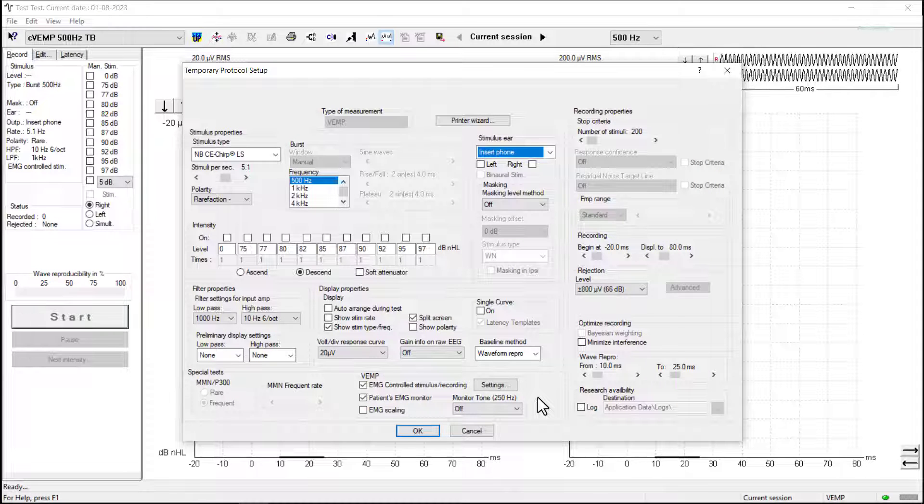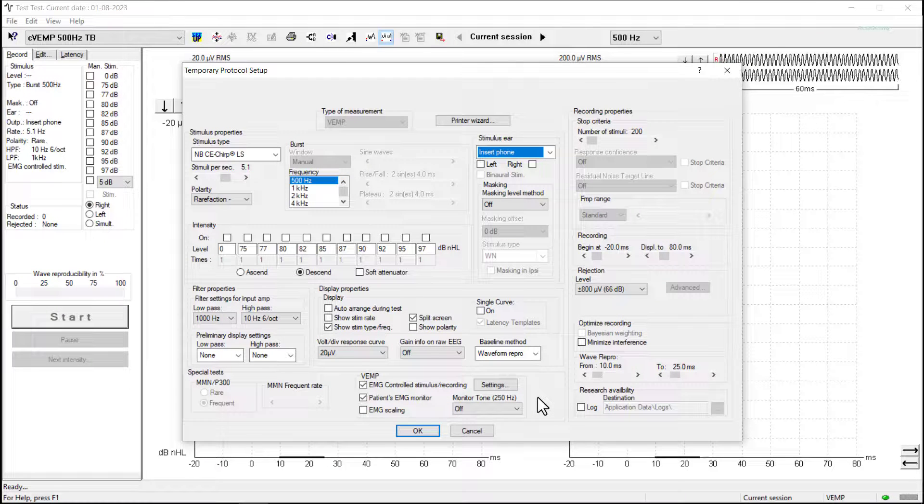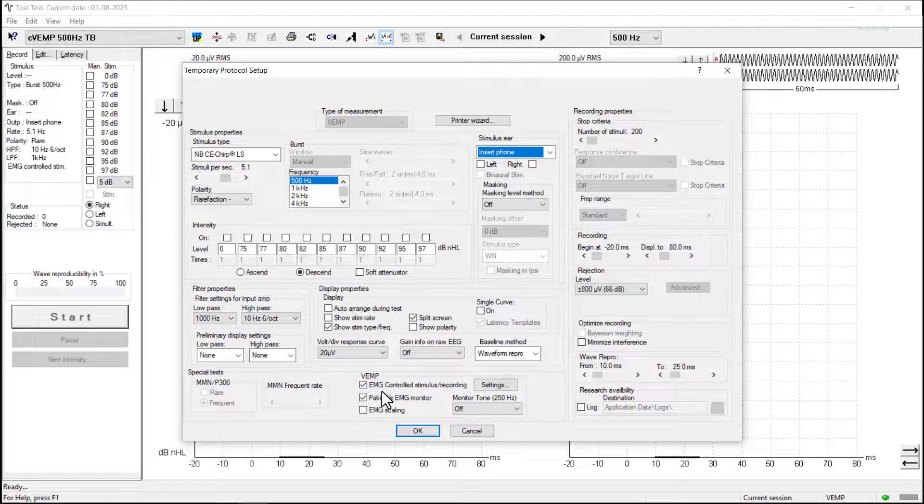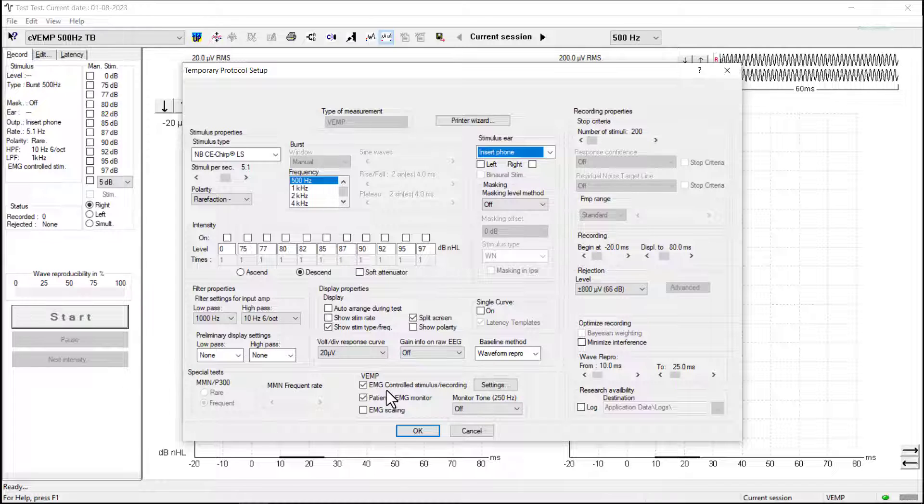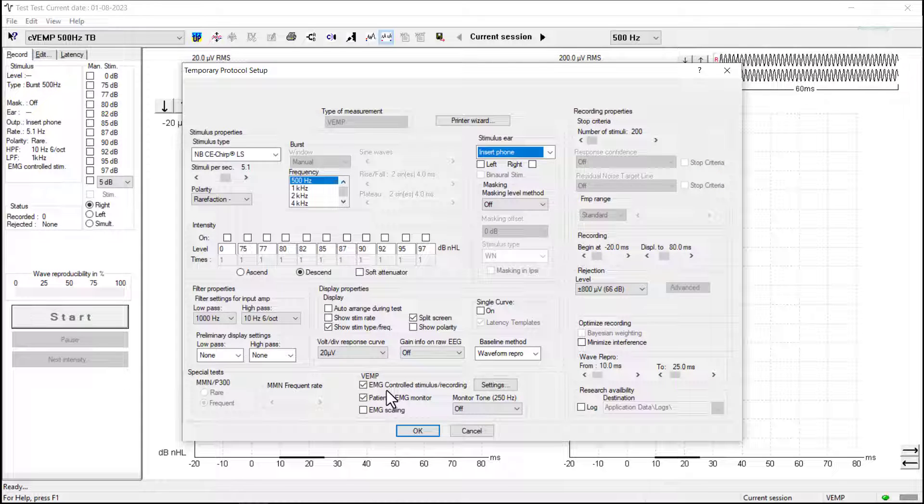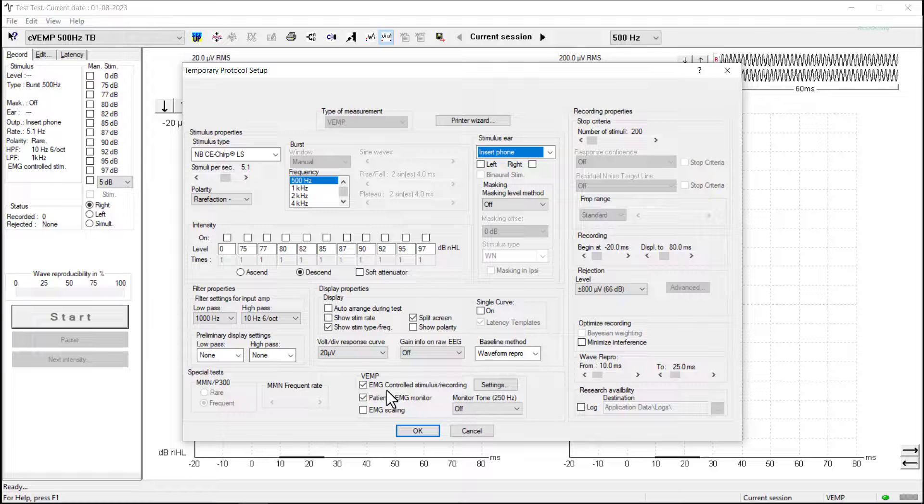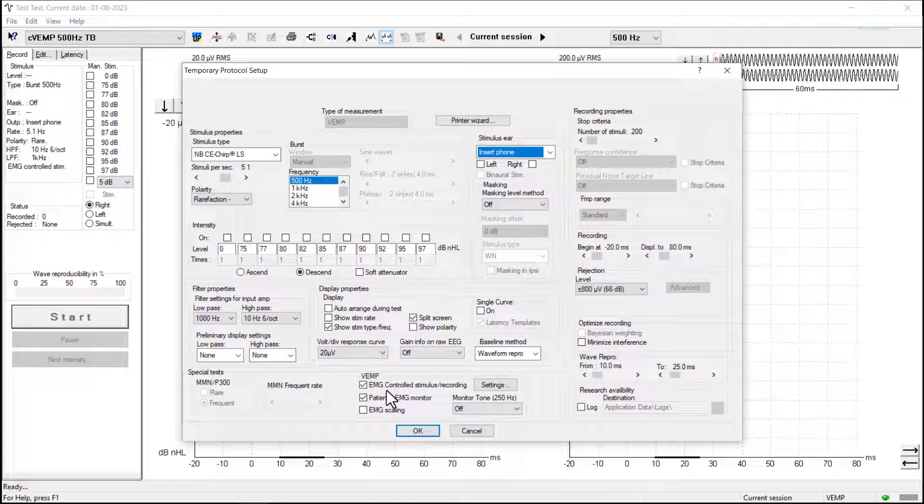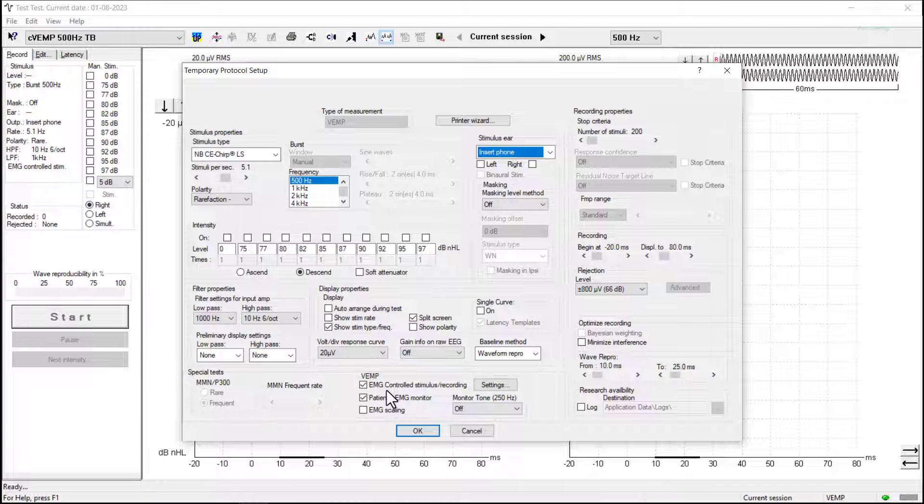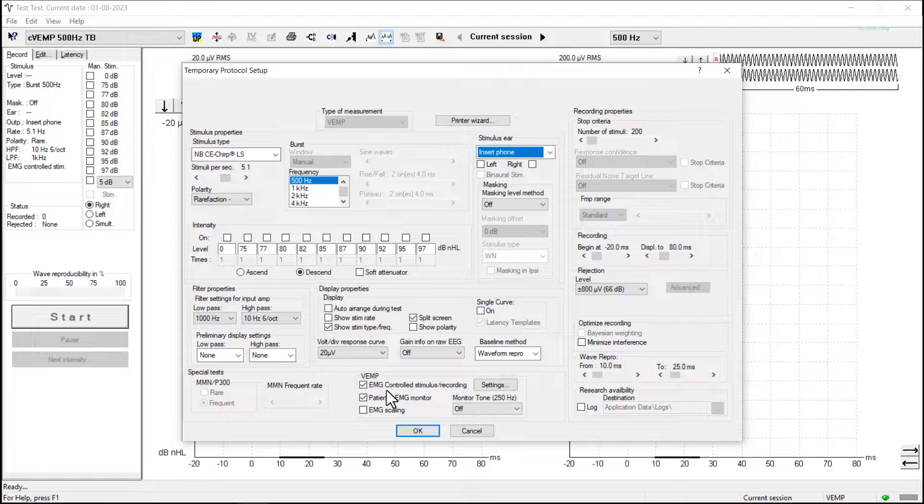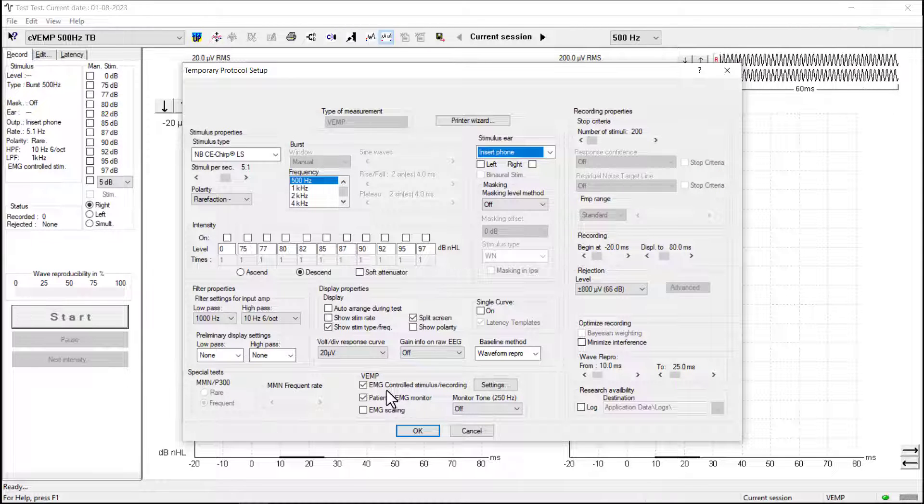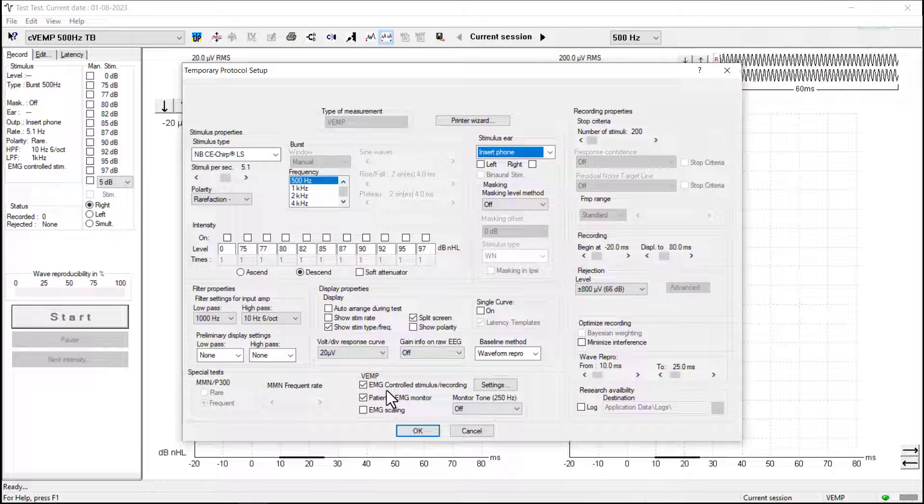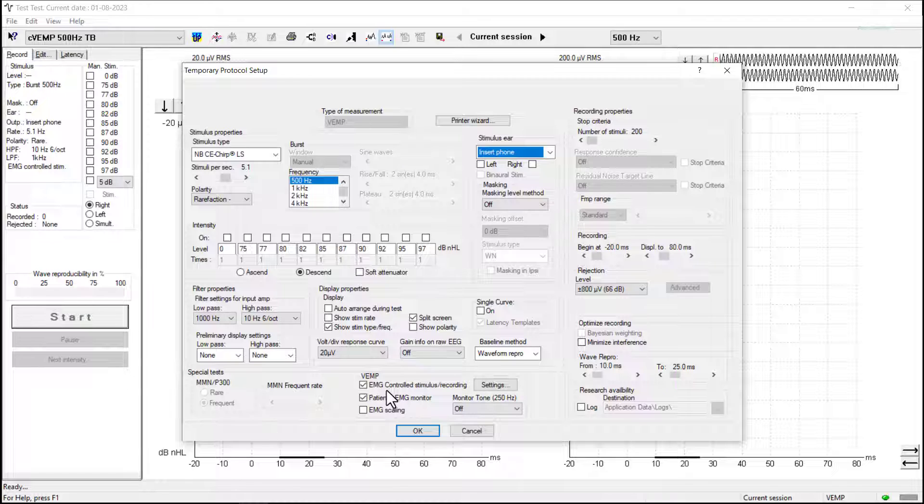Towards the bottom of the screen we can see some VEMP specific settings. The top line is the EMG controlled stimulus recording. If this is selected, it means that the stimulus will only be presented and the Eclipse will only record when the patient's EMG contraction is within the range that has been set. So if they do not provide sufficient muscle contraction, the stimulus won't present and they should hear that through the transducer that's delivering the stimulus.